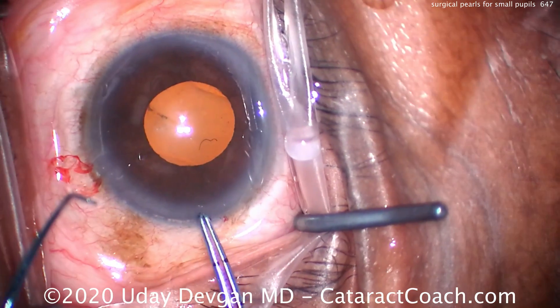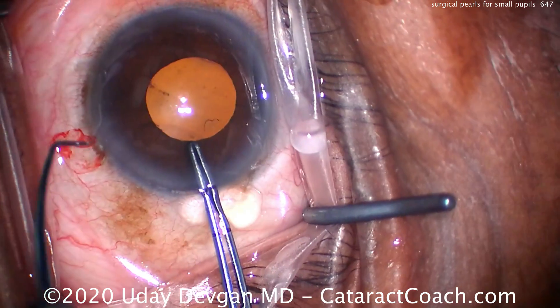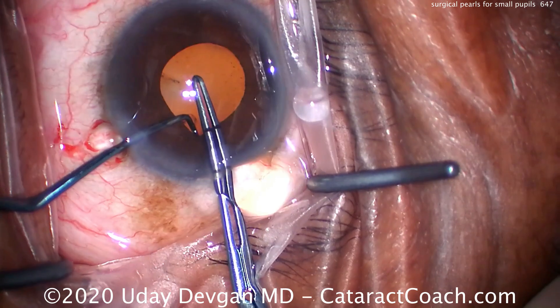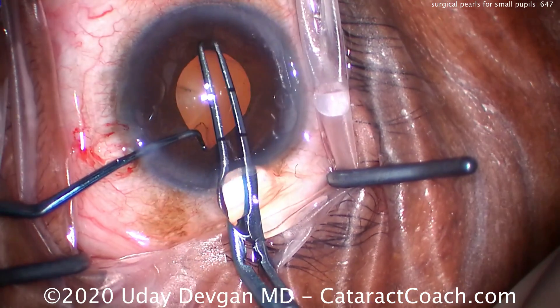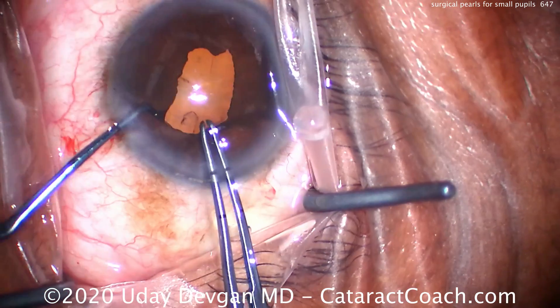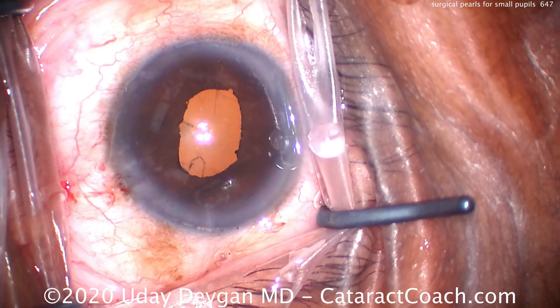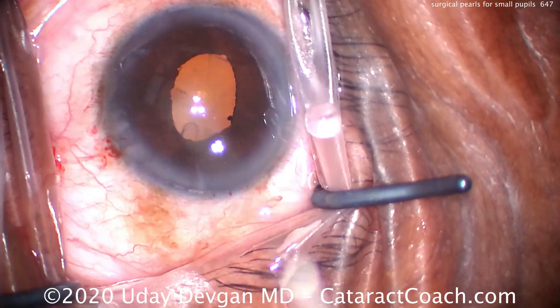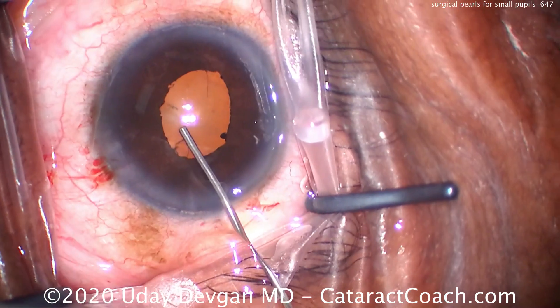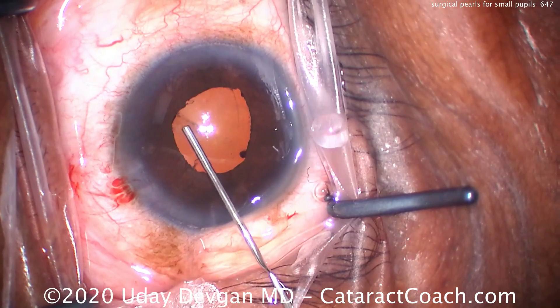Now, before we do the rexis, there's another trick. Watch this. Using my capsularexis forceps in one hand and the chopper in the other, we're going to do some pupil stretching. There are other instruments available for this, but I happen to have these two instruments on my tray. Now that we've stretched the pupil out, we can inject a little more viscoelastic, and lo and behold, we can achieve an even better pupil size.